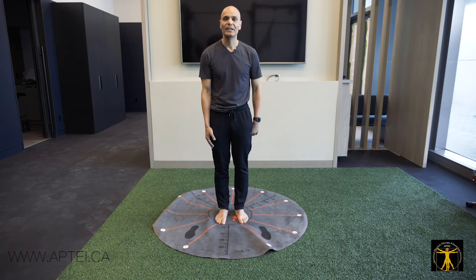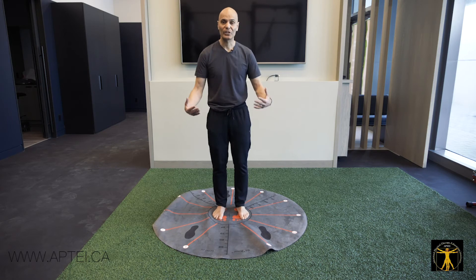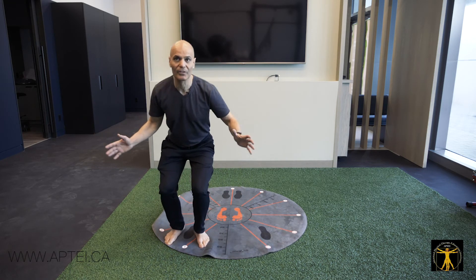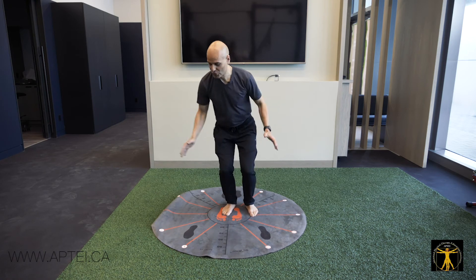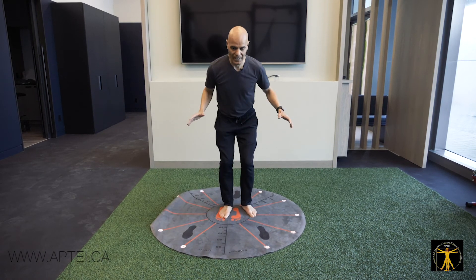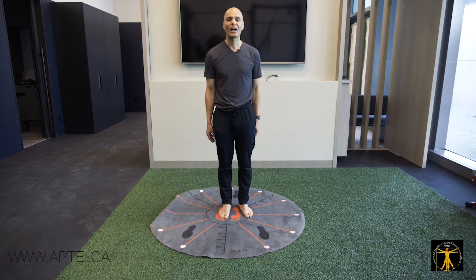The progression is to do long jumps, but slow. This is an amazing quad workout for eccentric retraining. You jump to 1 o'clock and catch yourself, then come back. Jump to 2 o'clock, catch yourself, come back, and so on. Once with eyes open and once with eyes closed.